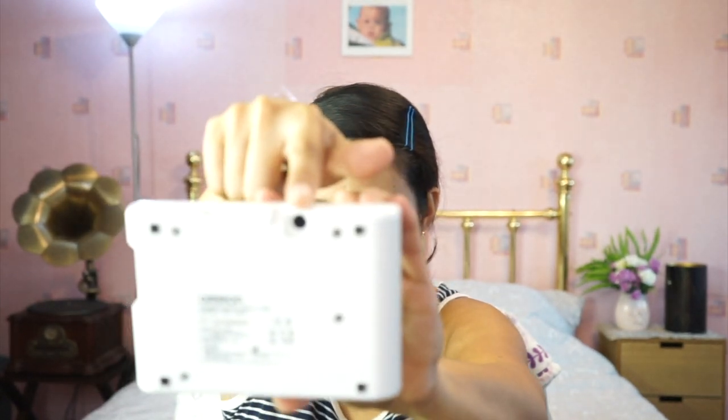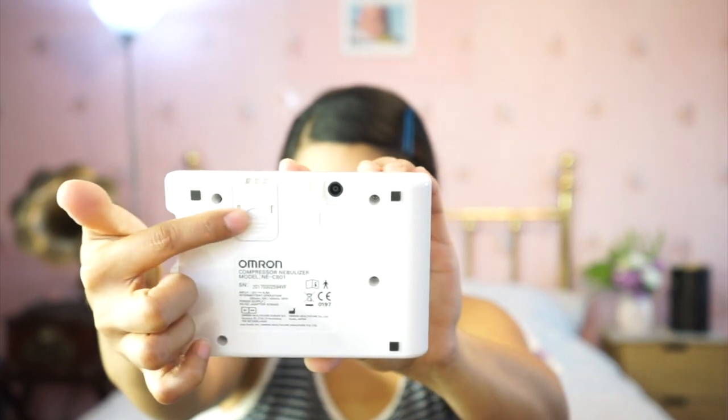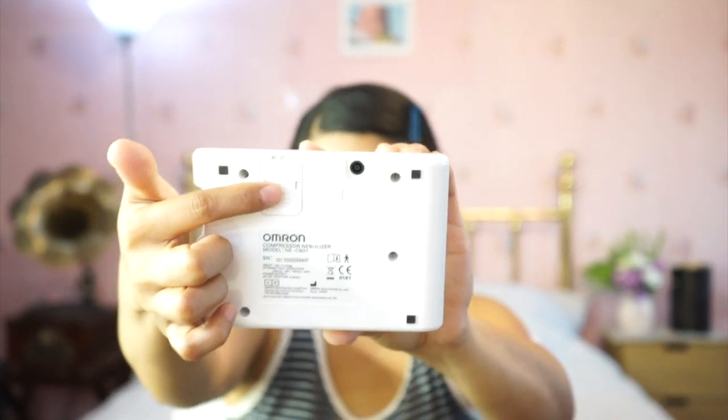And also in the box you can see the compressor itself — it's this small. On the back, this is where you place the adapter connector. And this small slot here is where you place the filter.